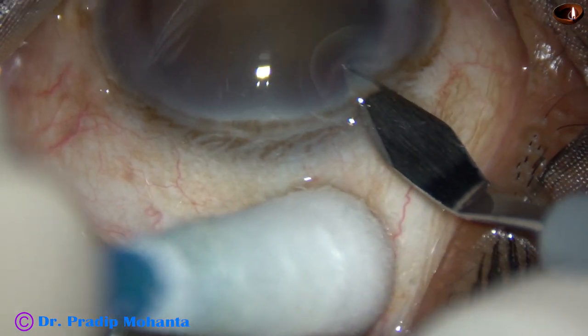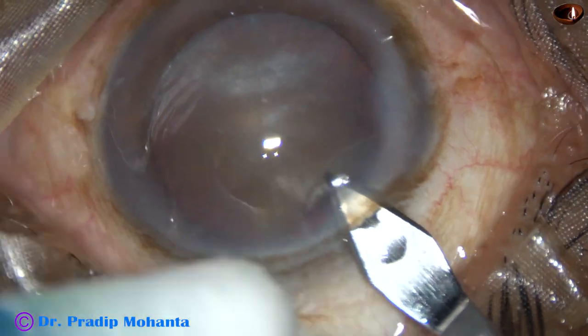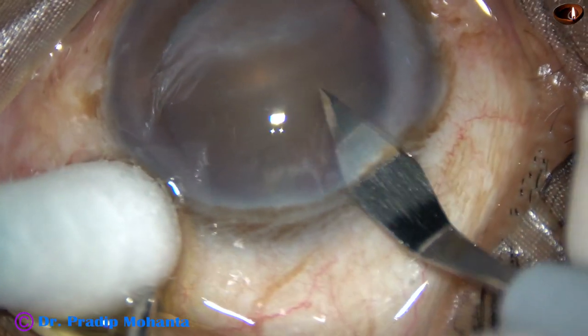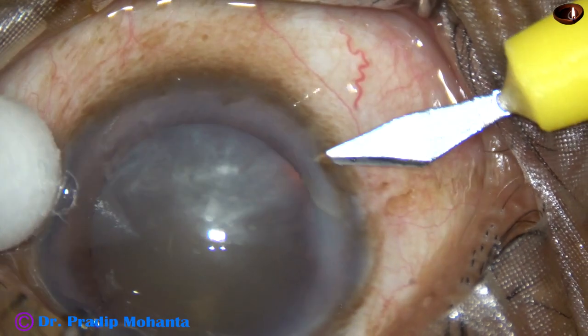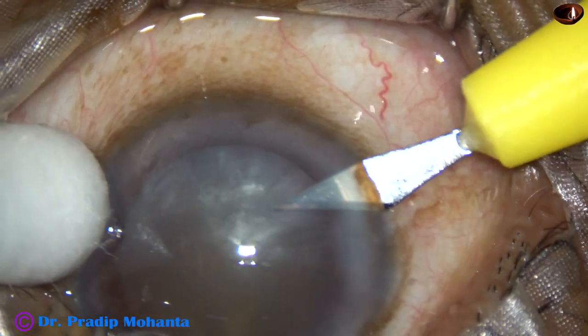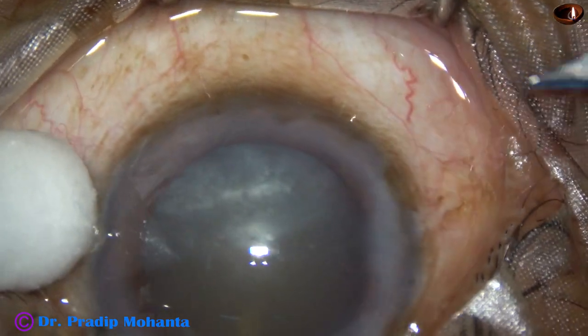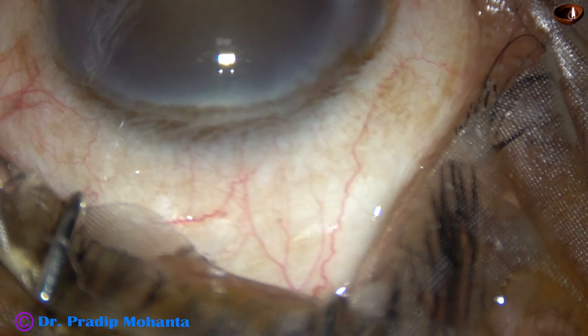This is the main incision. The patient is under topical anesthesia and is not able to cooperate well. The main incision has been made with a 2.8 mm steel keratome. This is a side port on the right side of the main incision, and this is another side port on the left side of the main incision.